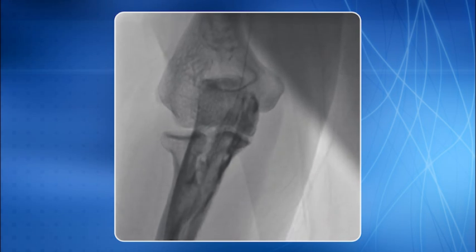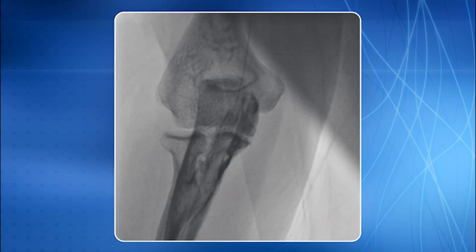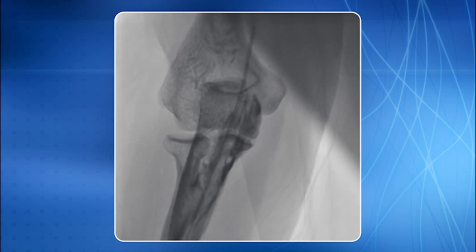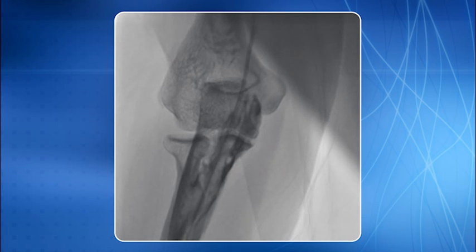May it be a guide catheter or a diagnostic catheter, make sure that you are using a corkscrew movement just to avoid further friction, and the affected segment is crossed with the catheter. Once the catheter crosses the affected segment, the procedure is done in usual fashion.